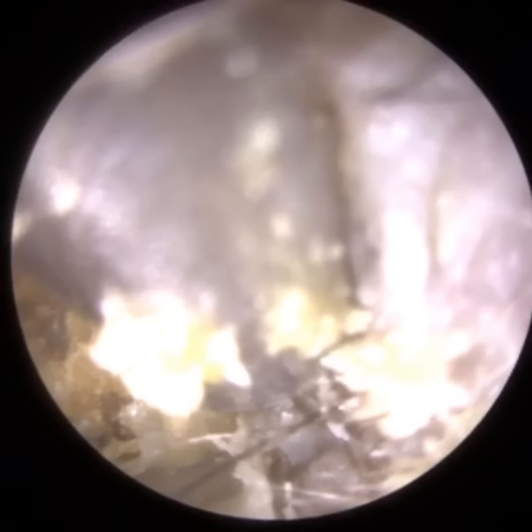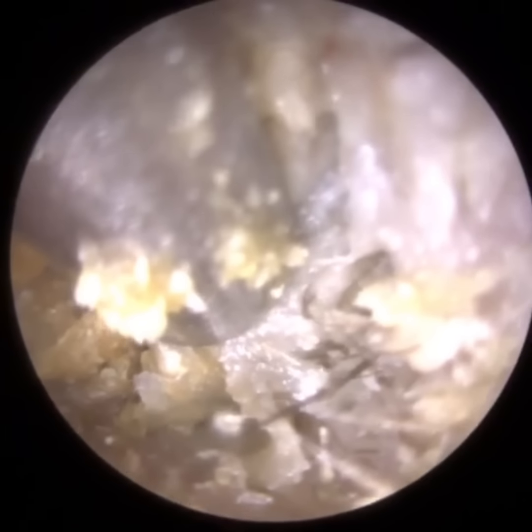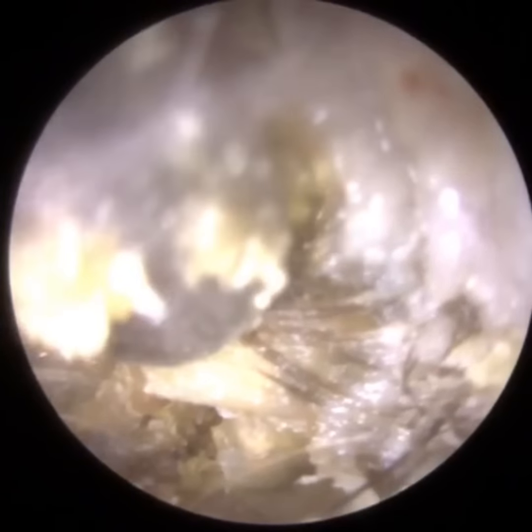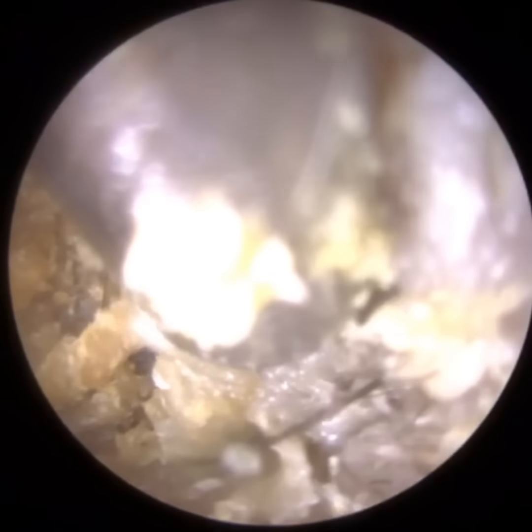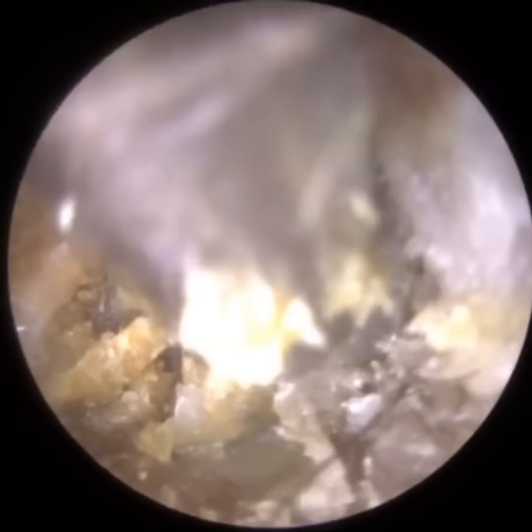Where we are now is what we call the osseo-cartilaginous juncture. This is where the cartilage portion of the ear canal, the outer third of the ear canal, meets the bony part of the ear canal, the inner two thirds. And this skin plug, this Keratosis obturans, has got trapped here. Keratosis obturans typically occurs more in the bony part of the ear canal.